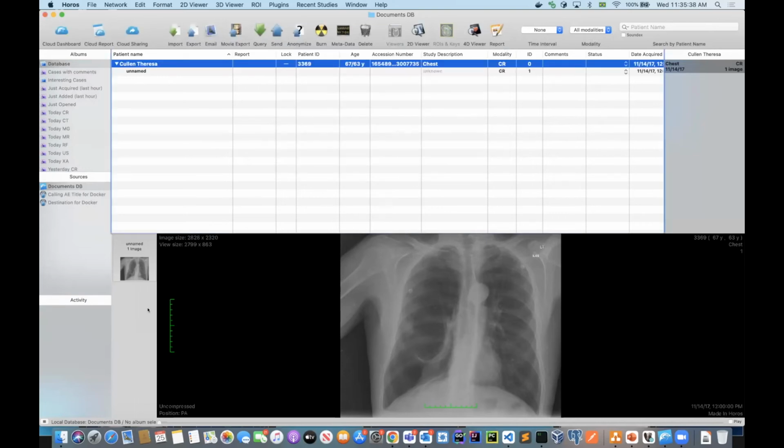Now Conductor is running the workflow. I can show the workflow later. But now the results came back as per Conductor. If you see here, it was added within the last 6 seconds. This mock model is just copying the input to the output. It's not doing inference per se. But if it was the real model, you would see a second image here coming with this thing highlighted, which was one of the slides that I showed before.